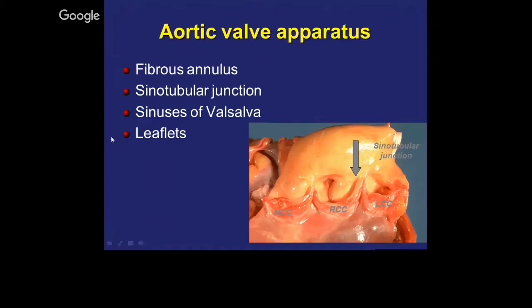The aortic valve, just like the mitral valve, is not just the valve. It's got a fibrous annulus, there's a sinotubular junction, the sinus of Valsalva, and then the actual leaflets. You can see here the sinotubular junction, this is the non-coronary cusp, there's the right coronary cusp, and this is the left coronary cusp.